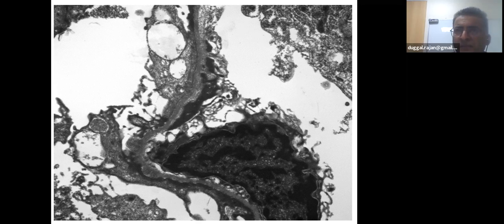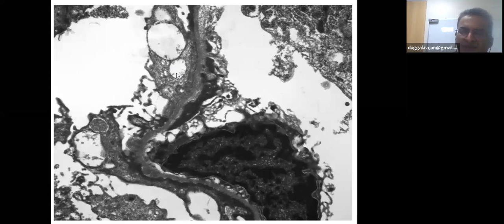But ma'am, when there is fibrin, there will be a history of malignant hypertension, and on morphology I'll find something of a thrombotic microangiopathy kind of finding. So many times in electron microscopy you see certain things which are actually processing artifact rather than true pathologies. The true pathology is a diffuse podocytic effacement, there is cytoplasmic vacuolization in the podocyte cytoplasm, and we are seeing a segmental sclerosis lesion with the light microscopy.